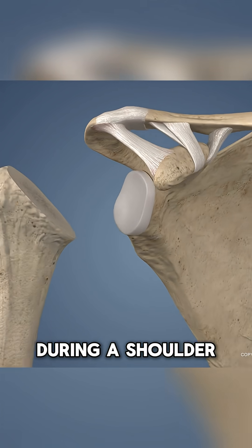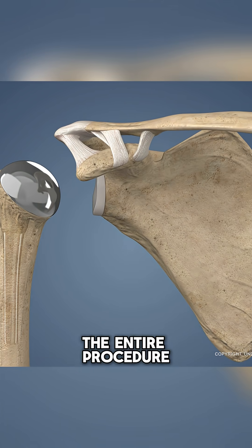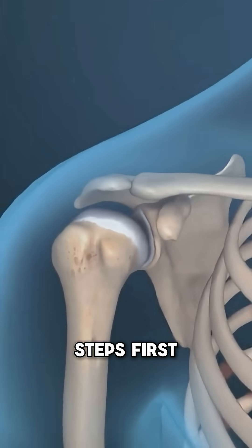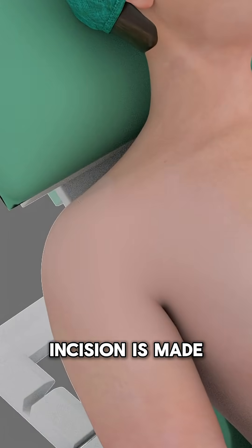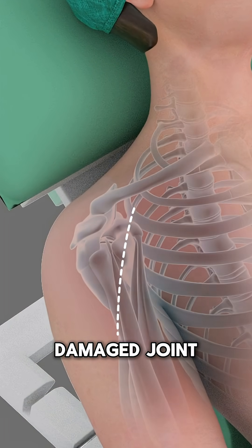Ever wondered what actually happens during a shoulder replacement? Let's break down the entire procedure in six quick steps. First, the patient is put under anesthesia, and a small incision is made over the shoulder to access the damaged joint.